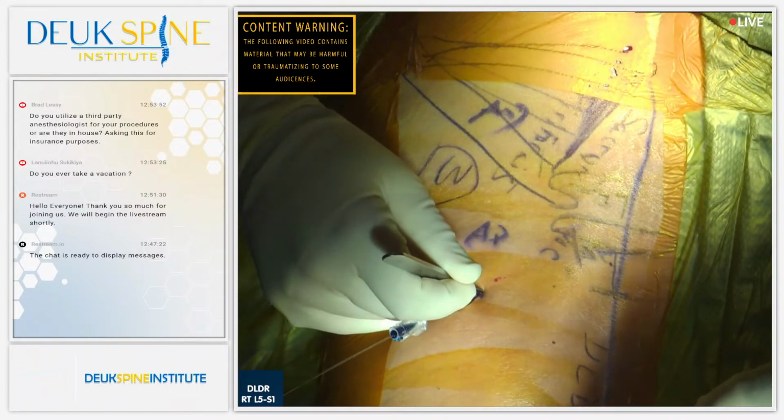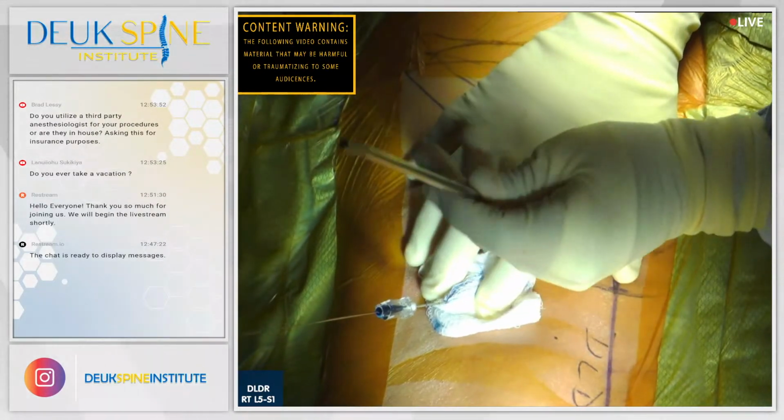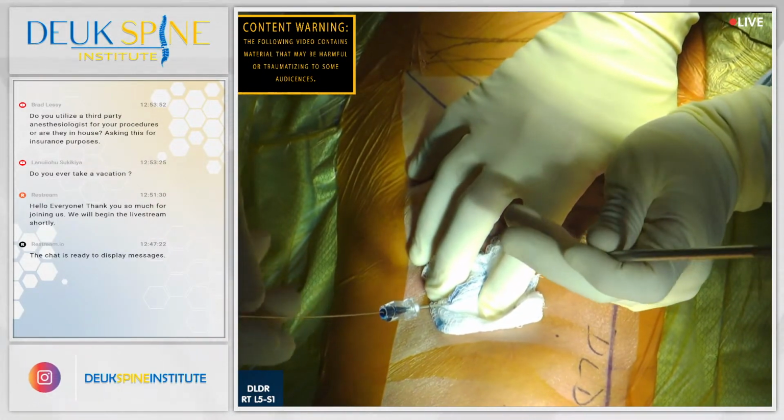Henry, did we show the audience yet how discs cause pain? Yes, we did. Let's show them how this surgery works. Of course.